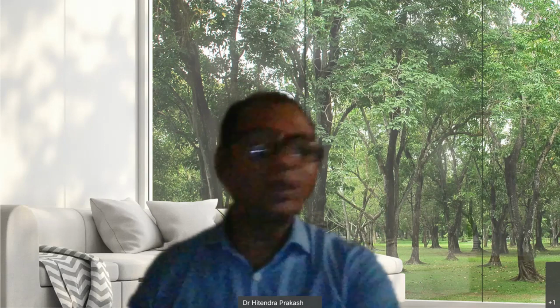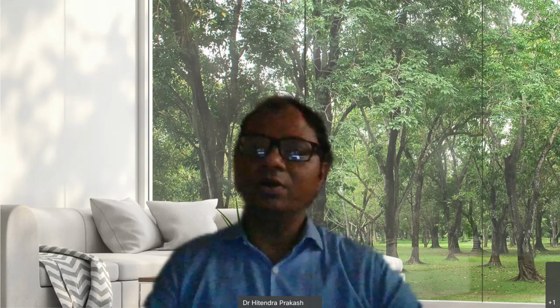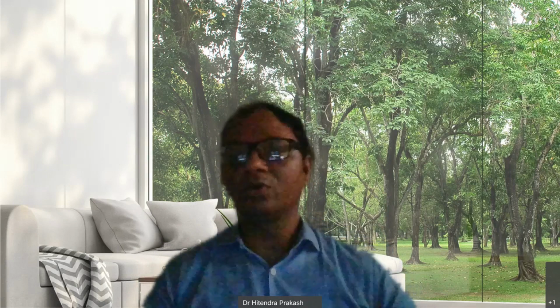To what level? Ideally, lowering of the facial ridge should be done up to the level of the facial nerve. It is recommended to lower the facial ridge till you see the bony facial canal.